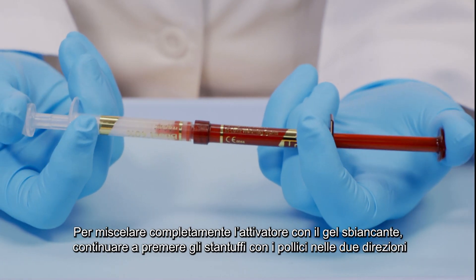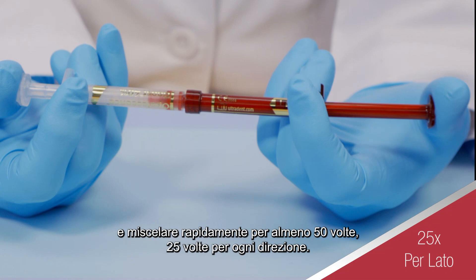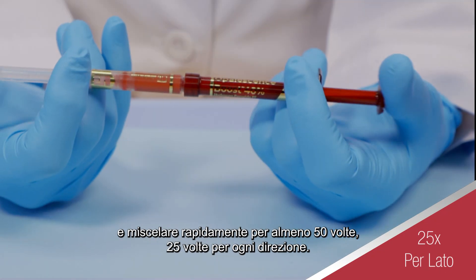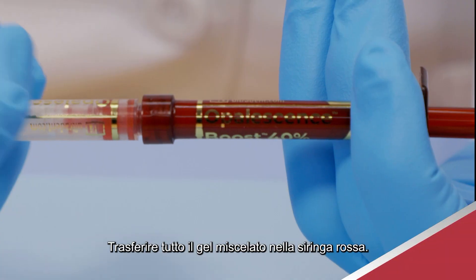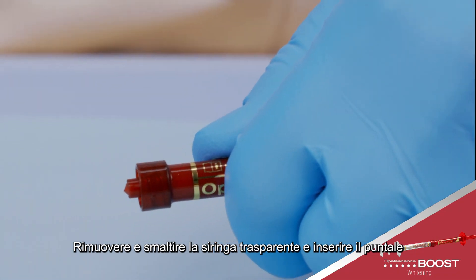To thoroughly mix the activator with the whitening gel, push stems back and forth continually with thumbs and mix a minimum of 50 times rapidly — 25 times each side. Press all mixed gel into the red syringe. Twist to separate the two syringes and securely attach tip.